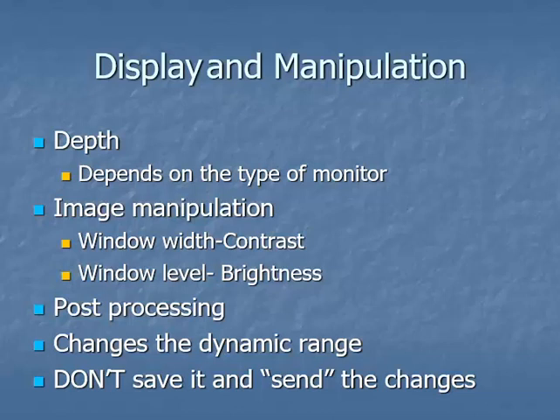So you don't post-process the image, save the processed image, and then send that to the radiologist. What you want to send is the original image. If you want to post-process and make it look better on your monitor and then send that too, that's fine. There are very few radiologists that are going to complain about one too many images on the rare occasion. Now, if you do that with every single image that you shoot, where you send what looks good to you and what should look good to them, yeah, they're probably going to complain about that.